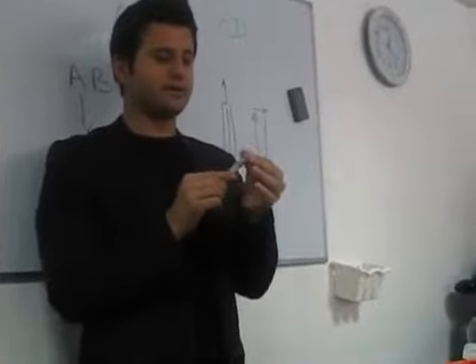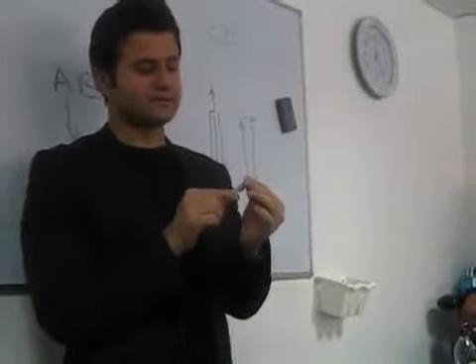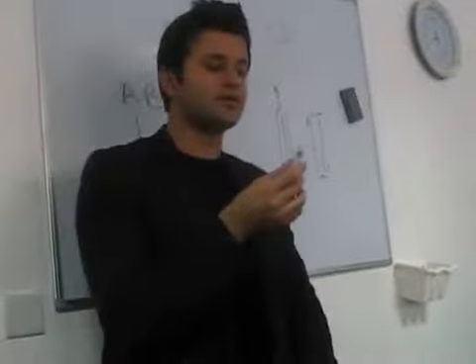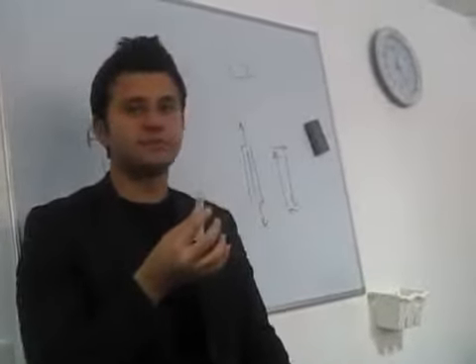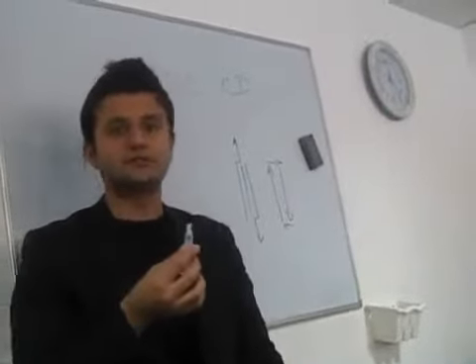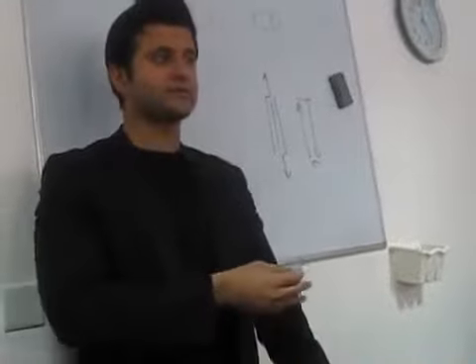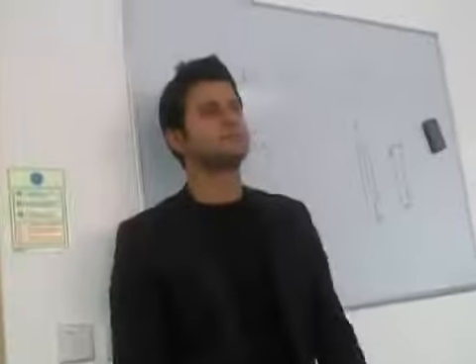If it's not nearby, I'll label it with my patient's details, his date of birth and his hospital number. I'll also write down the concentration of the oxygen that my patient is on, his oxygen saturation and temperature, and I'll immediately send it off to the lab for testing. When I'm done, I'll thank my patient and ask him to unroll his sleeve. Thank you. Should we have to write our own name on the syringe or not?